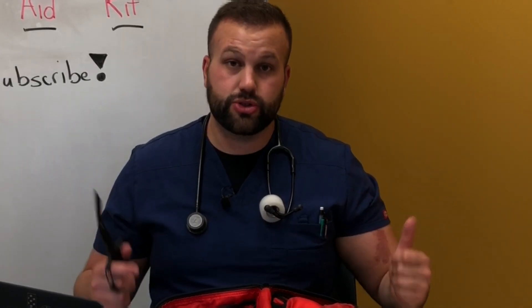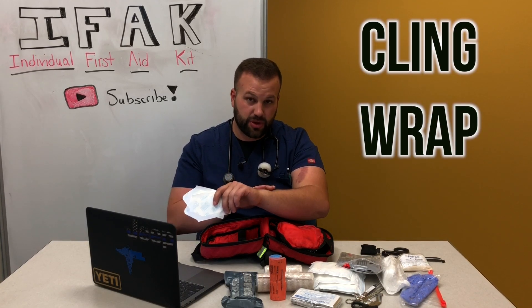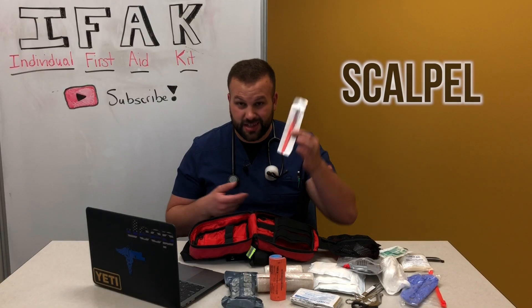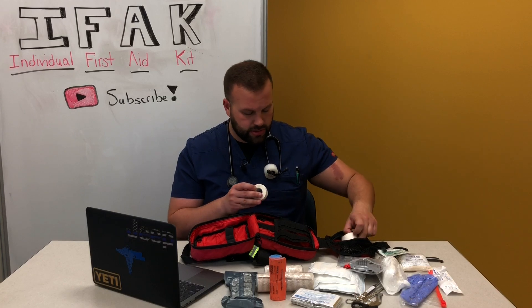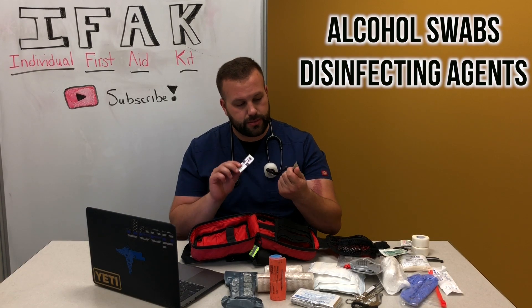Next up are Tegaderm patches. If you get a small but deep wound that you've packed with gauze and want to keep dry, this plastic adhesive film acts like a cling wrap right over the wound. Something you probably won't see too often: a scalpel with a safety cap, in case trauma shears can't do the job or you need to cut at a funny angle. I do carry a lot of tape, plus miscellaneous items like alcohol swabs, antibiotic cream, and Neosporin.